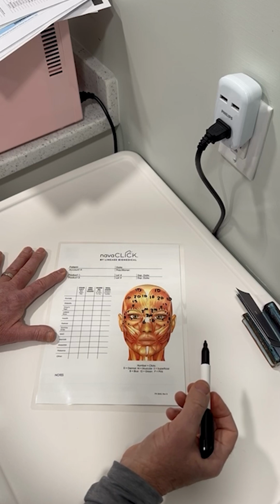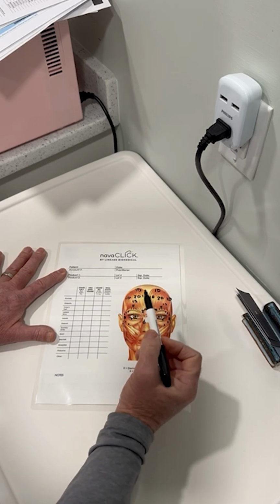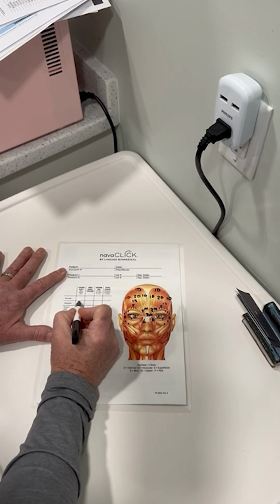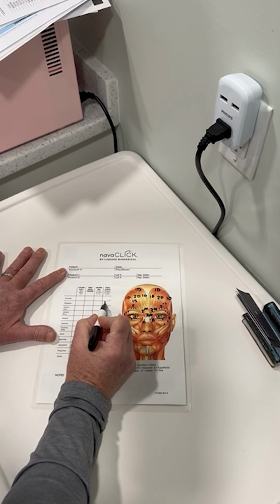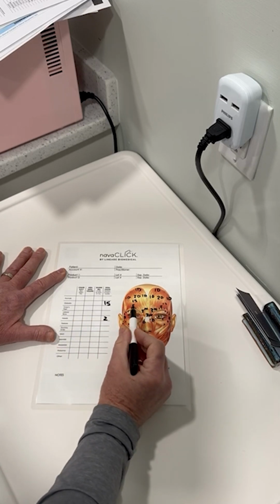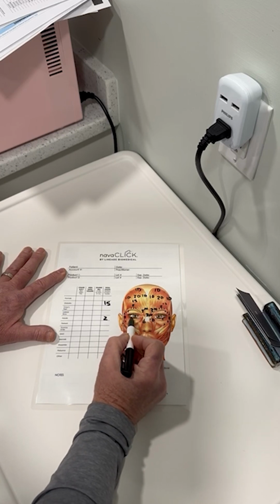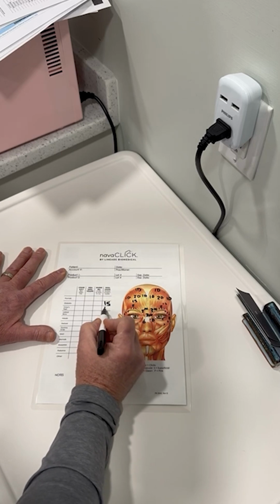I don't even know how many units I'm going to end up with, so I'm going to add it up and tell the patient what I think they need. So 3, 6, 9, 12, 13, 14, 15 in the glabella, and that's the number of clicks. Then I'm going to do 2 in the nasalis. I'm going to do 1, 2, 3, 4, 5, 6, 7, 8, 9 on each of the crows. So that's 18 in the crows.